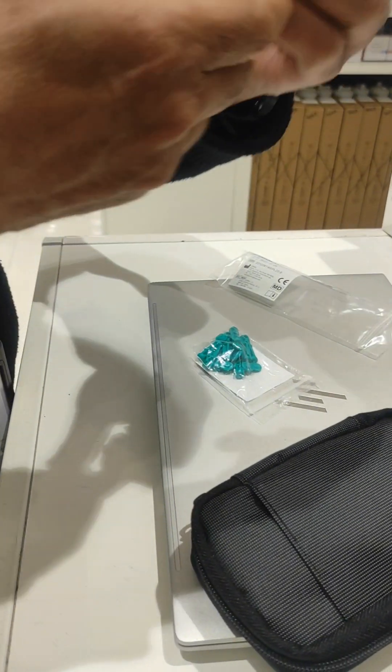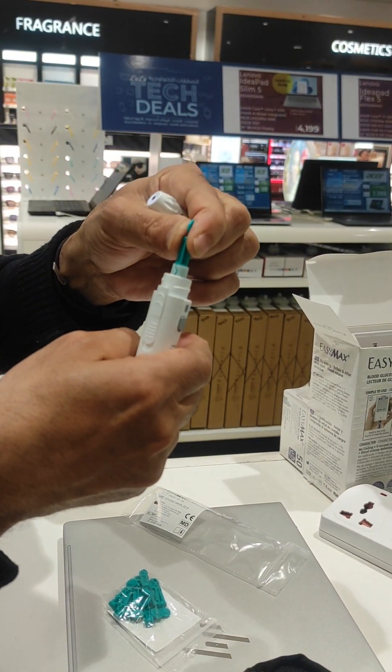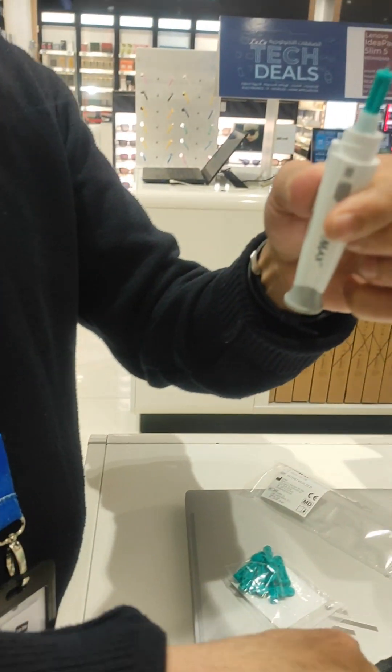Okay, this is the needle. Just remove here from this one, insert this, and remove the cap like this. Remove the cap like this.